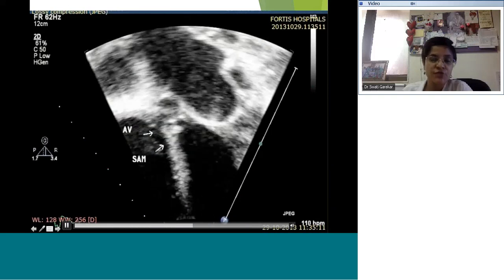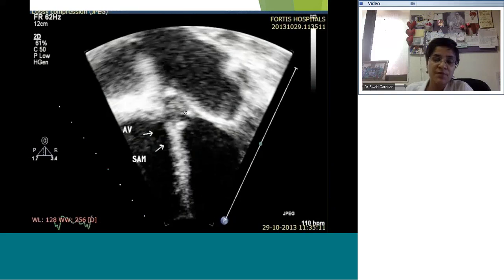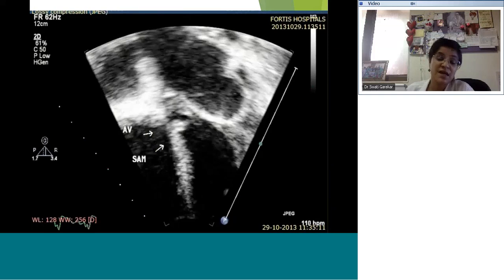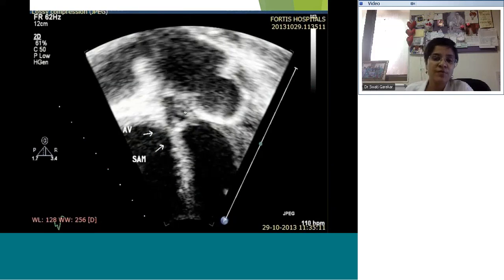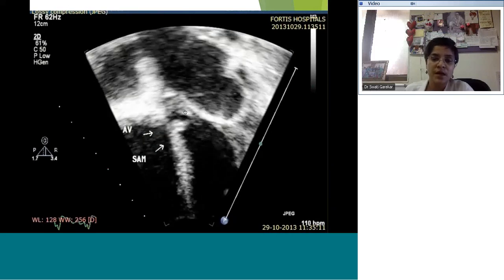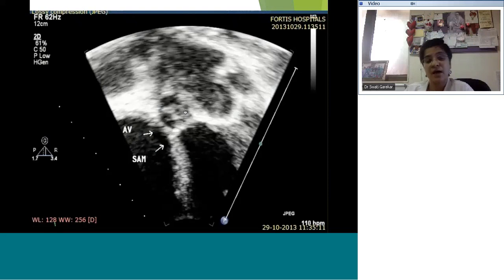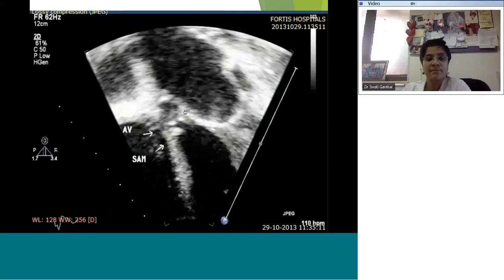Now, all this has to be examined very carefully and conveyed to the surgical team, because then we make a plan of either attempting to strip off the membrane, which has to be done through the aortic valve, or we think of putting in a new valve. Because if the membrane is very adherent to the cusp, how do we think we're going to be able to strip it out successfully? So it's nice when there's some 2-3 mm difference, a gap between the cusp and the membrane.